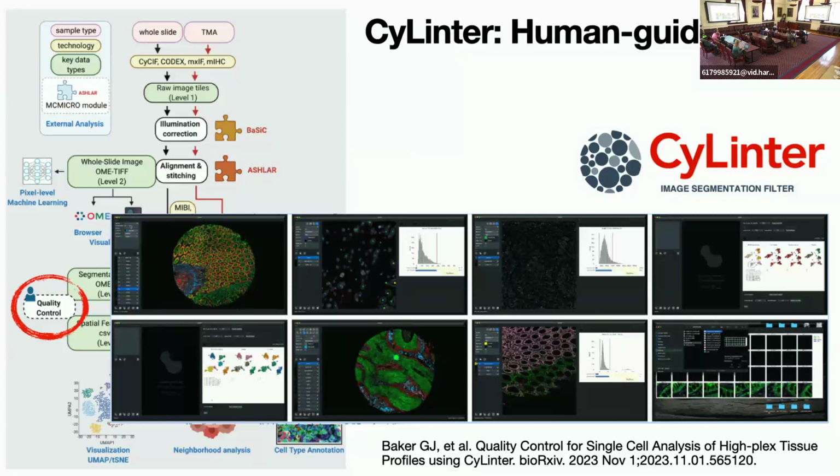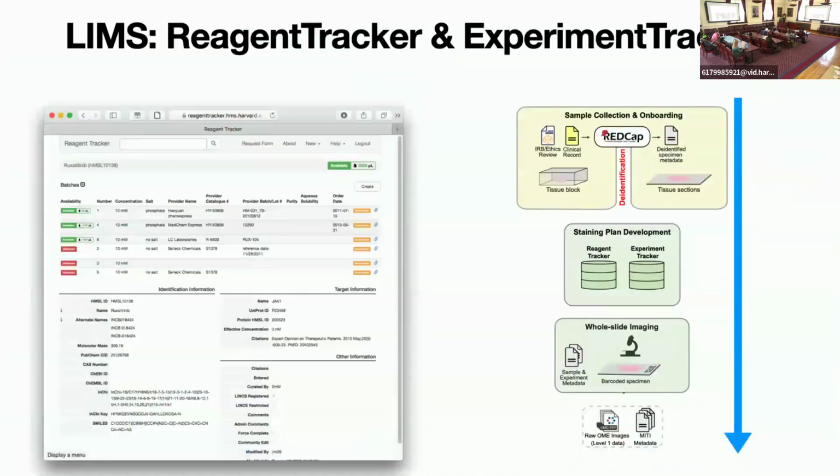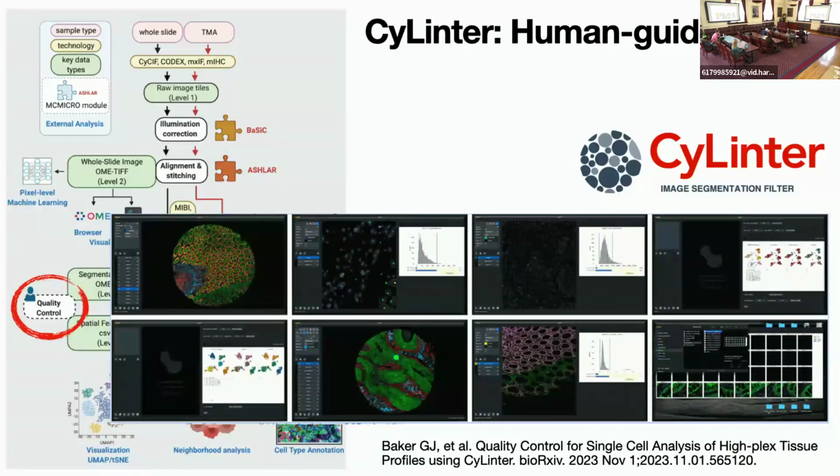And this is all based on Napari. It's a series of plots and data visualizations in Napari that let you load your image, explore the single cell data, explore the QC plots, and filter your single cell data to exclude the artifacts. I think this is in bioRxiv, and I think the actual paper should be out anytime soon. It's just in final review now.